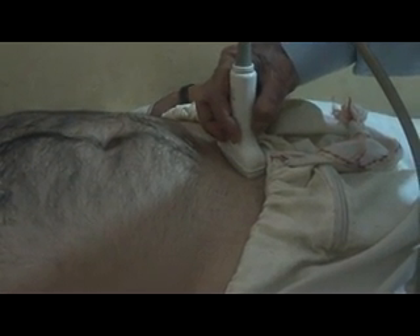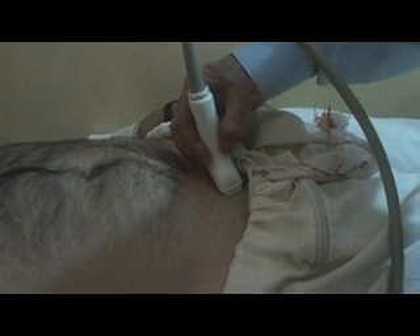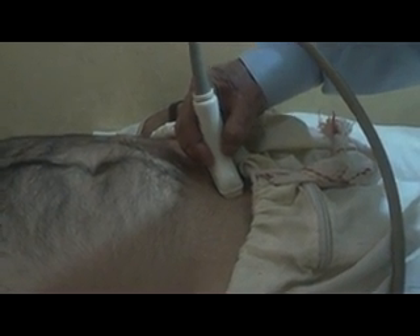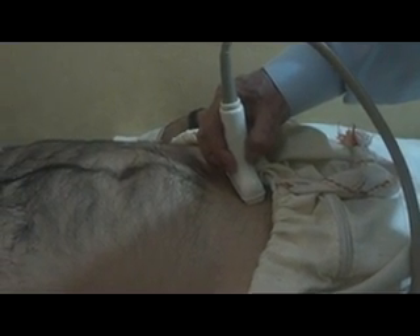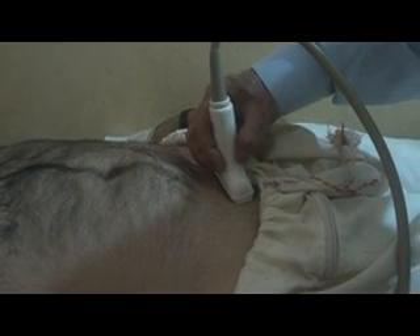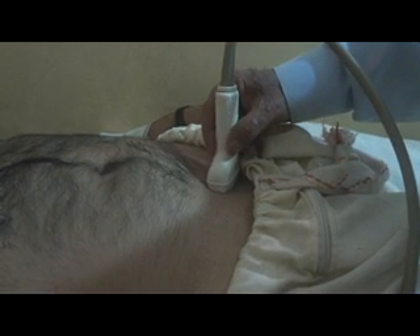So, we start the scan by placing the probe in the suprapubic region. Here I see the urinary bladder in the suprapubic region — this is the urinary bladder in transverse section.